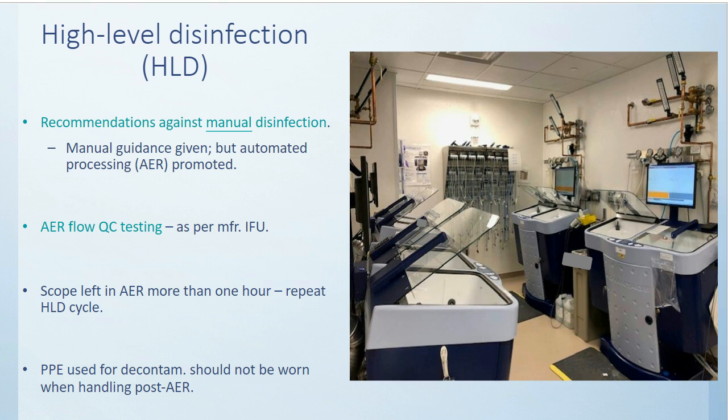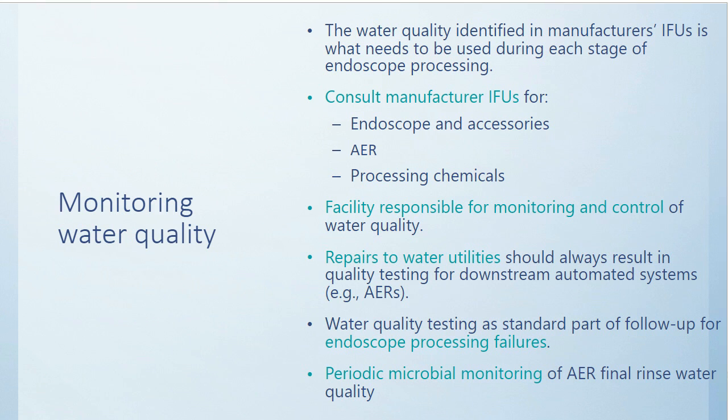Talking further about water quality, studies have identified endoscopes contaminated with bacteria, including waterborne pathogens, following high-level disinfection, despite adherence to processing guidelines. So the water that's used to rinse disinfected endoscopes was implicated in these cases.